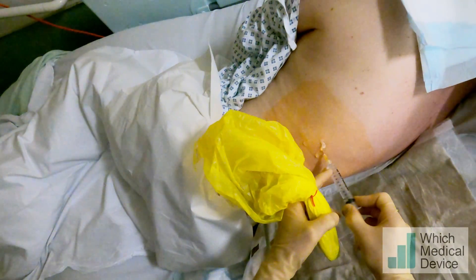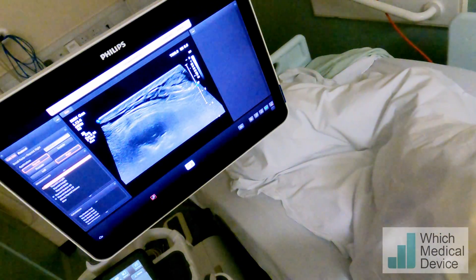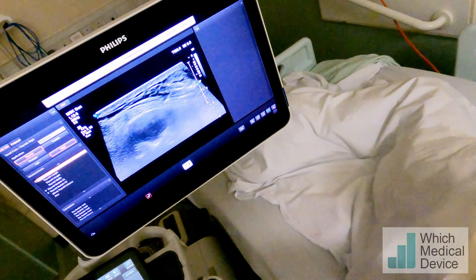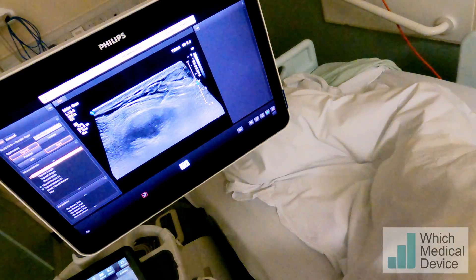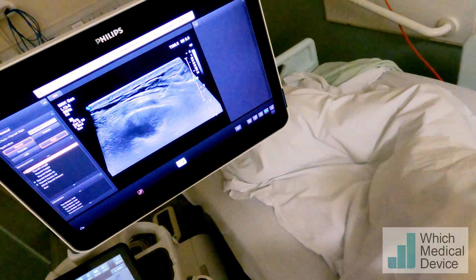That'll sting a little bit but hopefully not very much. You can see the needle very clearly there on the ultrasound. Is that okay?